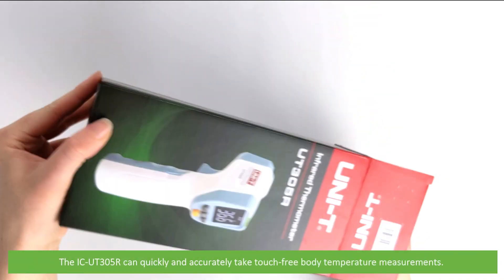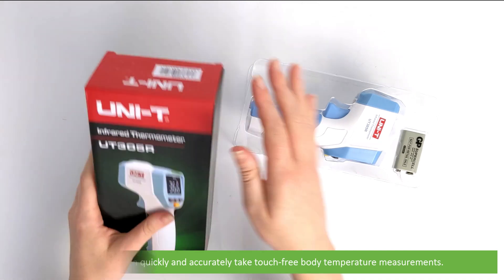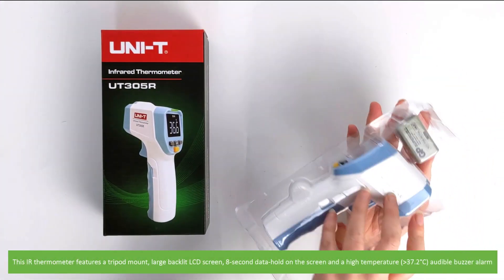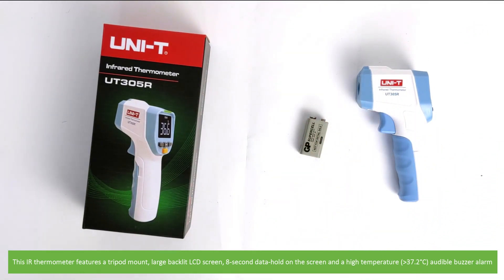The IC UT305R can quickly and accurately take touch-free body temperature measurements. This IR thermometer features a tripod mount, a large backlit LCD screen, 8 second data hold on the screen, and a high temperature audible buzzer alarm.